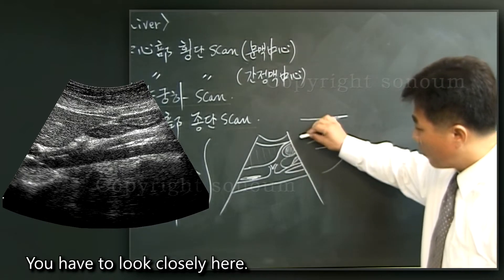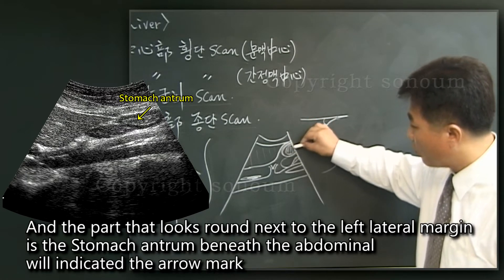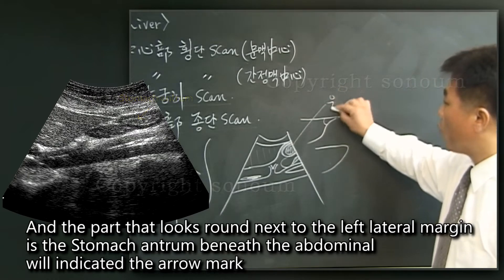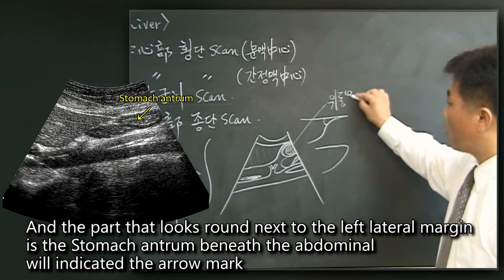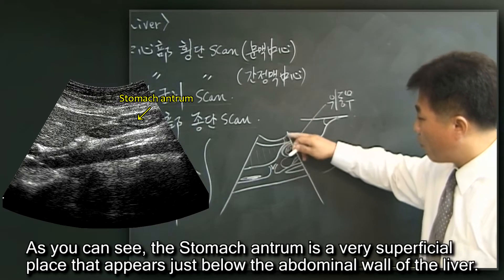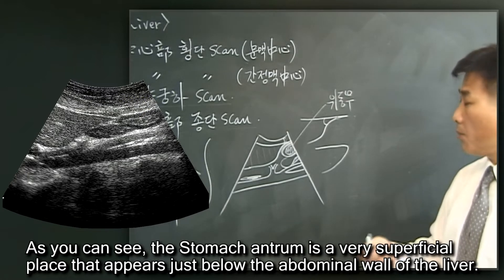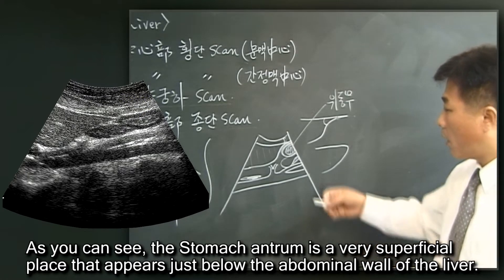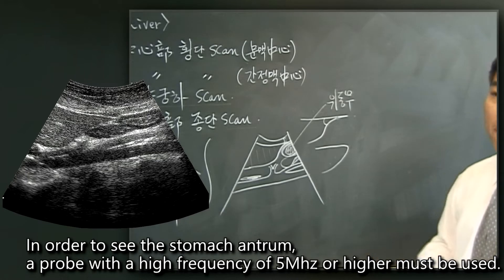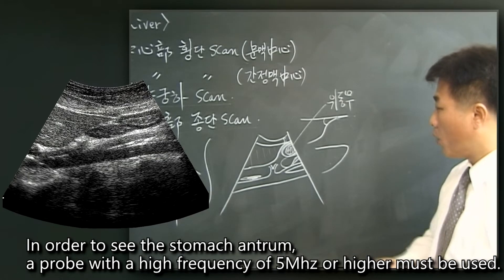You have to look closely here. The part that looks round next to the left lateral margin is the stomach antrum, indicated by the arrow mark. The stomach antrum is a very superficial structure that appears just below the abdominal wall of the liver. In order to see the stomach antrum, a probe with a high frequency of 5 MHz or higher must be used.